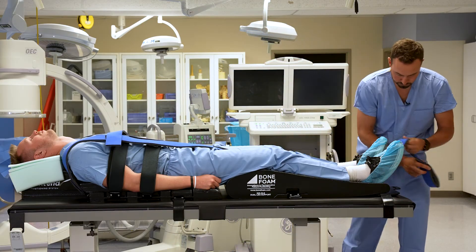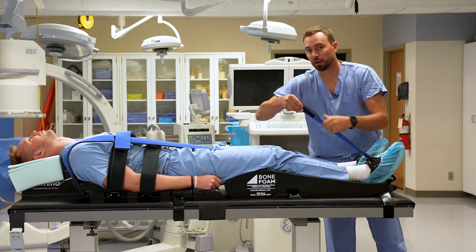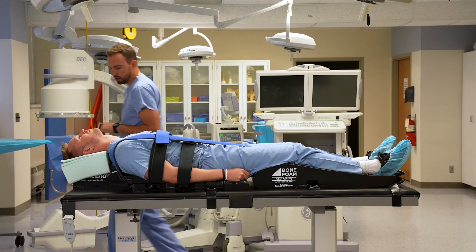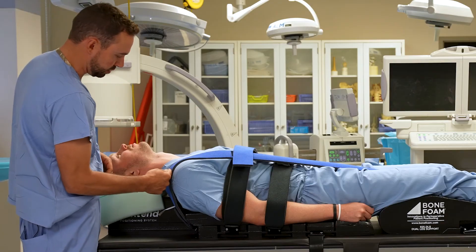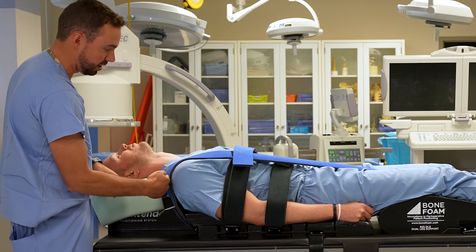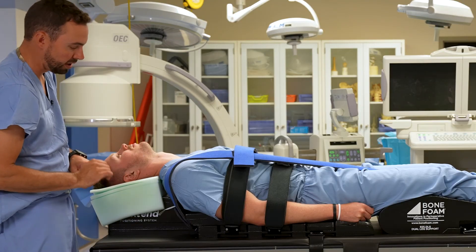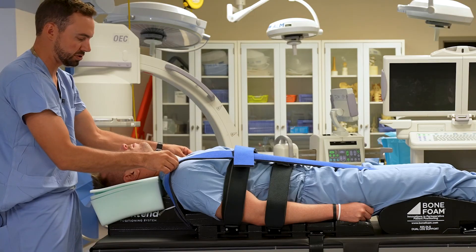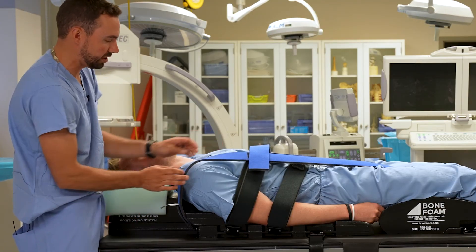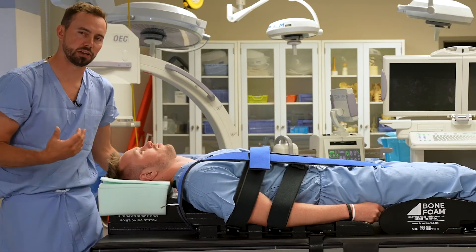In this setup, we have the Y-strap through the traction anchor for permanent traction. We do a little pull to get the shoulders where we want them, and the Y-strap attaches to itself. Now that Dawson is under static traction, I want to show the relationship between where his shoulder is and where it's anchored. We can see the strap is anchored behind and lower than the top of his shoulder — that allows it to pull down toward the bottom of the table. If the patient is positioned too low, the strap is no longer anchored behind the shoulder, and you won't get that symmetric depression — you'll just be tightening the shoulder to the table, which won't help your lateral image.